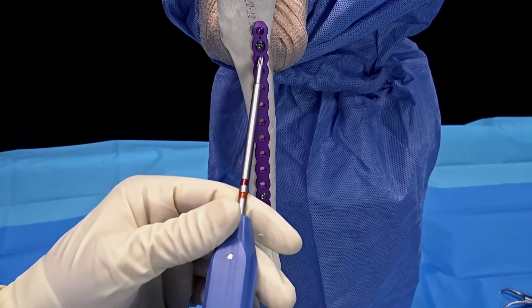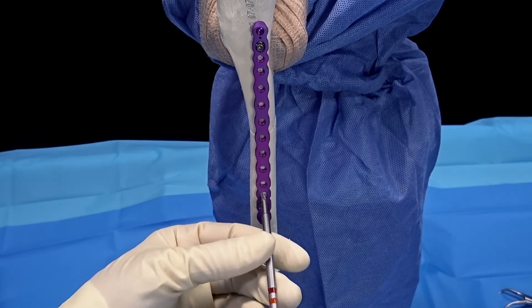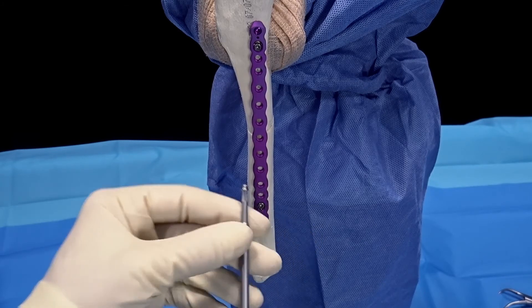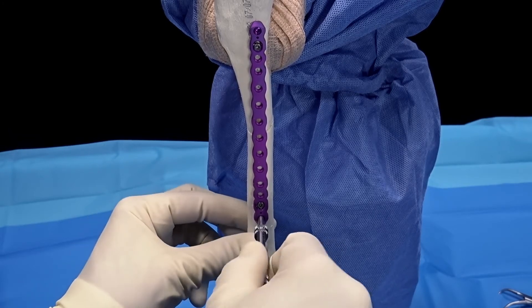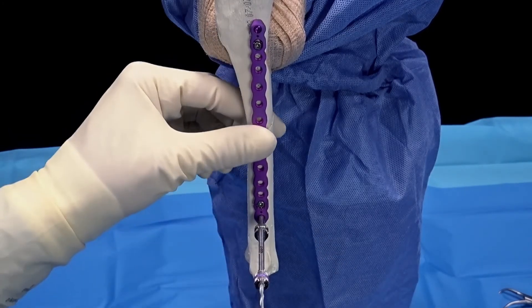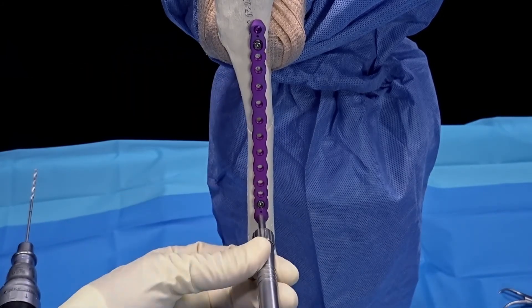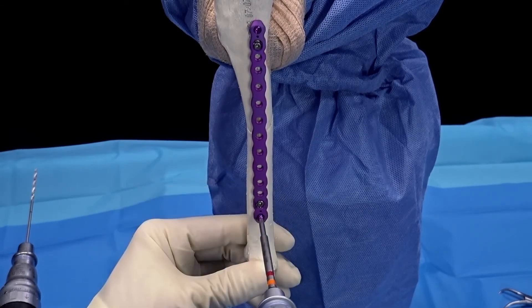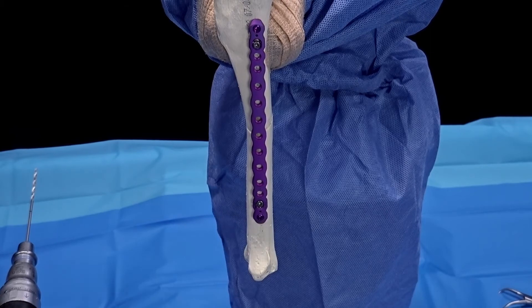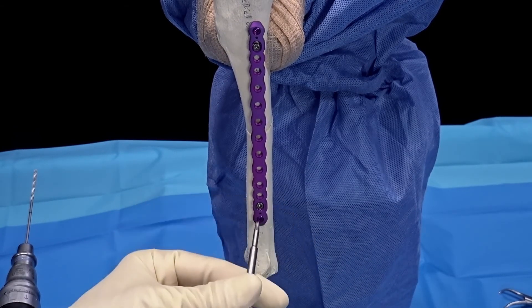Next, we're going to add locking or non-locking cortical screws to the proximal and distal fragments. We'll remove our plate bending plug prior to doing so. The locking screw can be driven by hand or using a power attachment. The final tightening of the screw should be done by hand. Again, that screw should sit just inset to the plate.